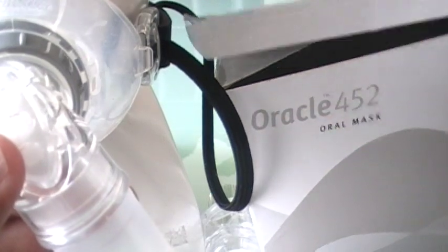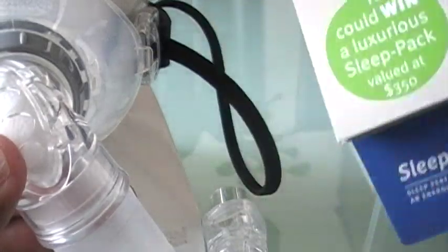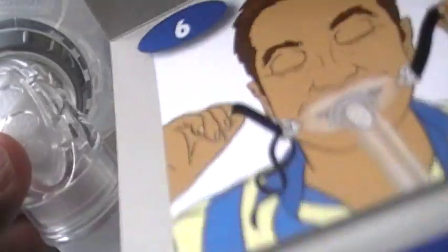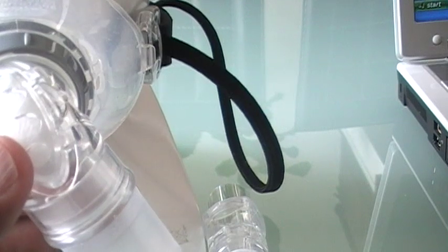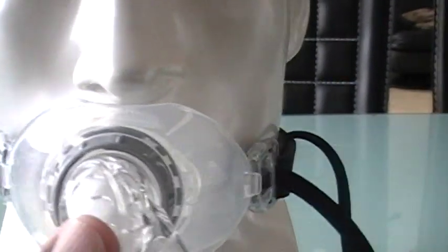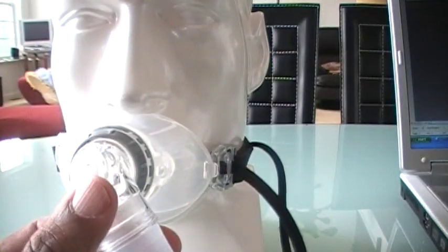It's called the Oracle 452 mask. It comes with instructions like this — like Ikea instructions with hardly any writing on it. Let me introduce you to the Oracle 452. This just goes into your mouth.